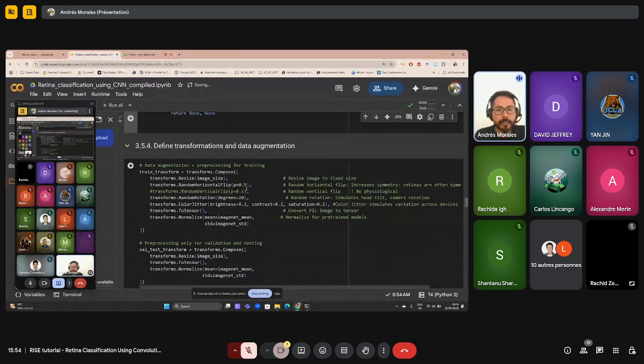So this is a relatively small data set for this kind of models, especially if the models are big. So how can we improve the performance of the algorithm without having to acquire more images? We use what is called data augmentation, which is basically computationally increasing the number of images by making some slight transformations in the data.